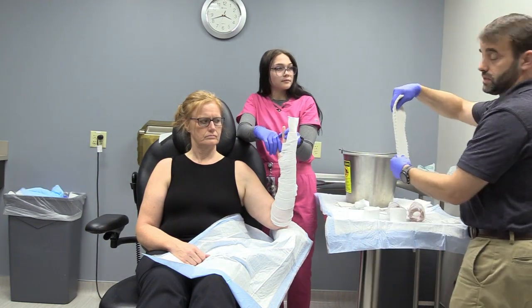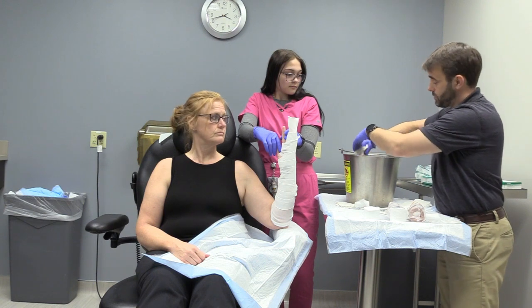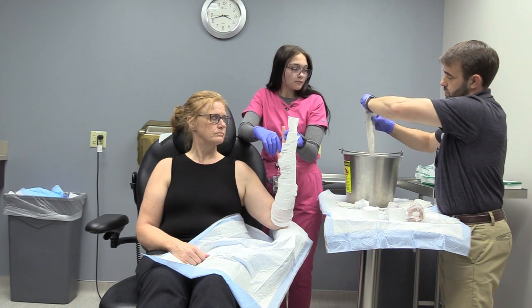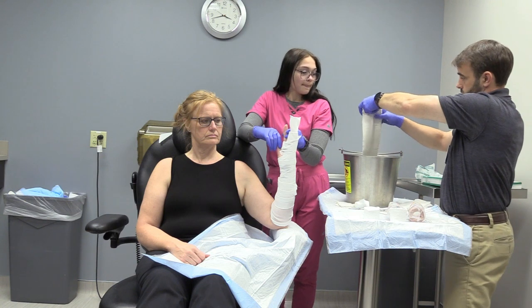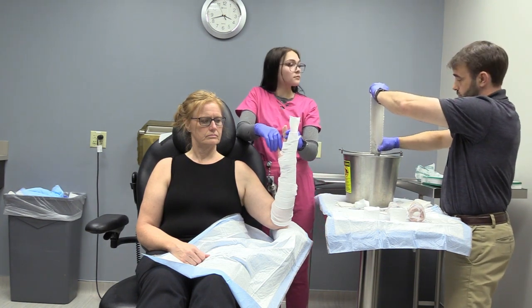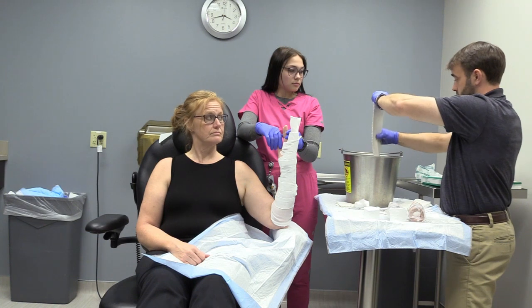Then all you have to do is make sure your patient's protected from splatter and get it wet. And when you're wetting plaster like this, you always want to massage it a little bit to get the layers to stick together. That'll give you a better bond and a stronger chunk of plaster when you're done. That also keeps some of the drippage from getting all over, which usually makes you more popular with your clinical assistants.